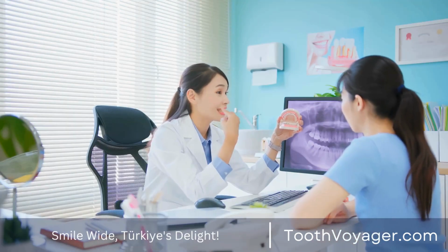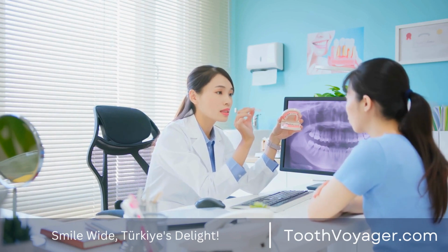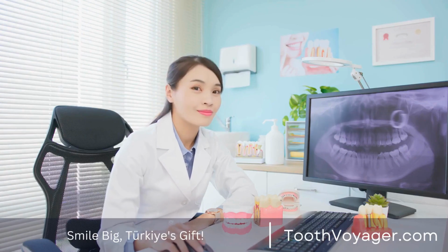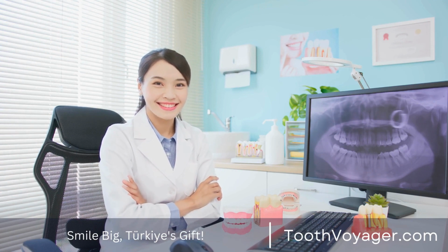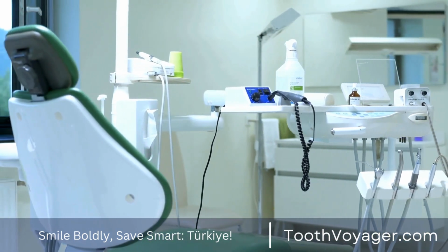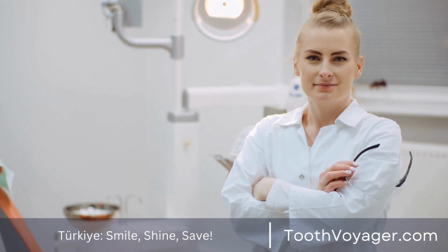But, thanks to advances in technologies and material, dental prosthetics can today be made to be seamlessly integrated with the rest of one's teeth and create a natural smile that's virtually identical to the genuine thing. The secret to creating realistic-looking replacement teeth is the material used as well as the expertise of the dentist making them. In the past, dental prosthetics were typically constructed from ceramics or acrylic. These materials may appear fake and do not have the transparency and feel that natural teeth have.